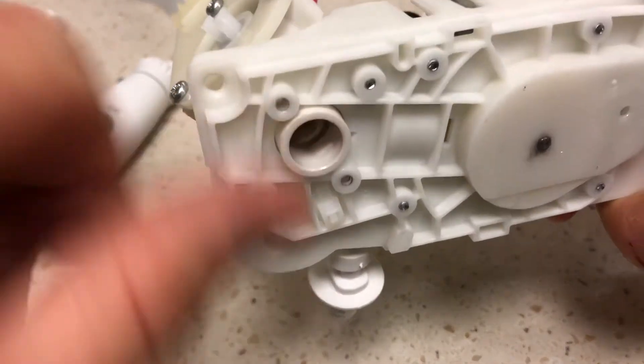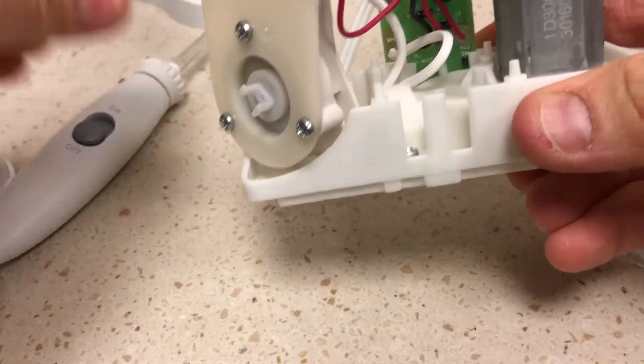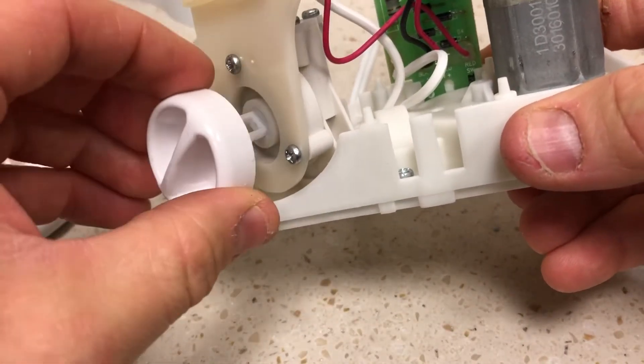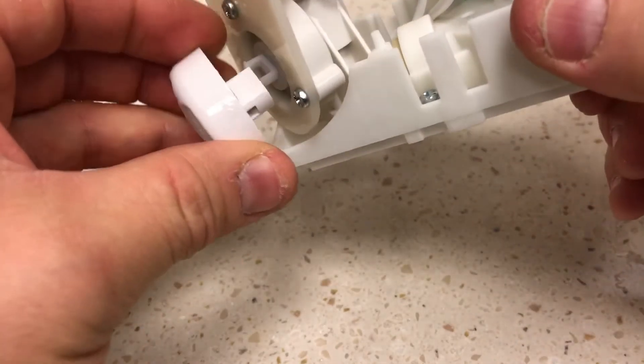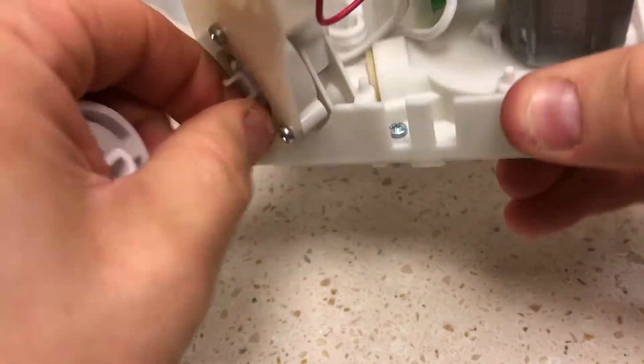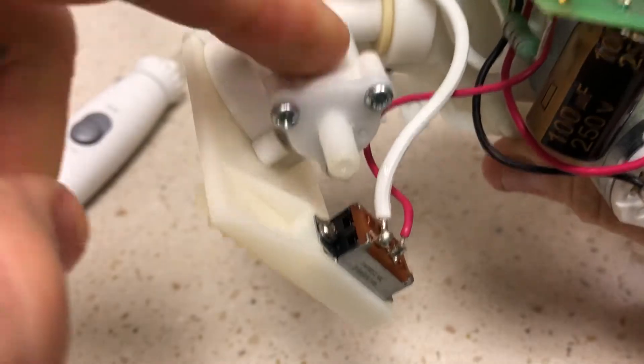The rotary control, which is this, for the water pressure, is essentially mechanical — it doesn't do anything electrical. It just rotates some component inside of this pump.